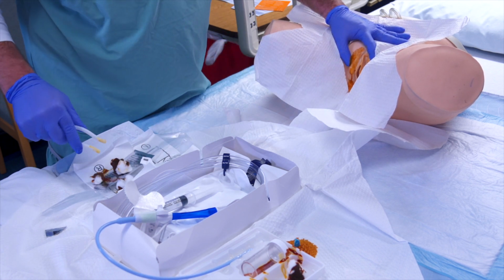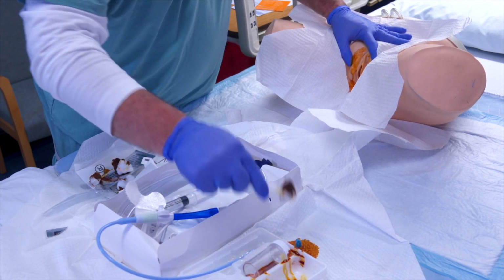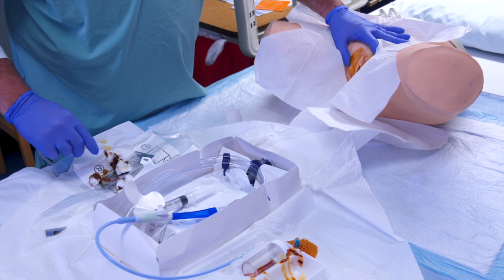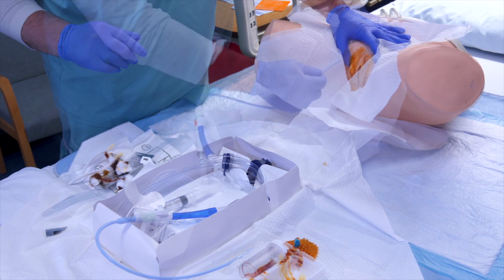Explain to the patient that you will now begin the insertion and that they may feel some pressure and should take a few deep breaths. Caution them to remain still during the procedure.